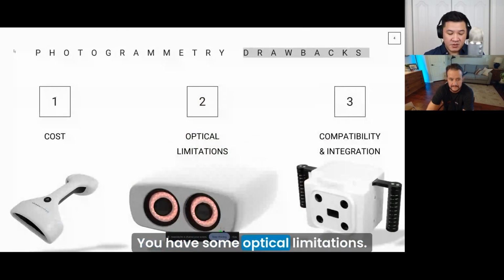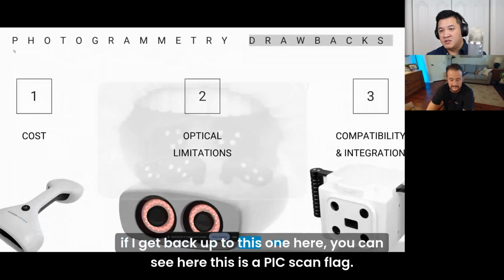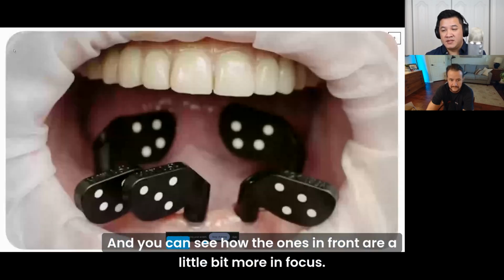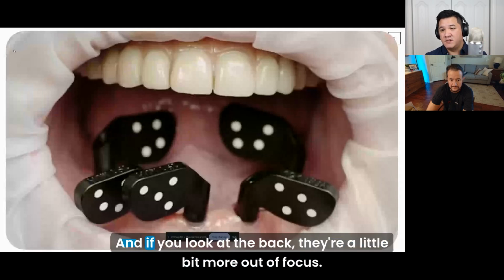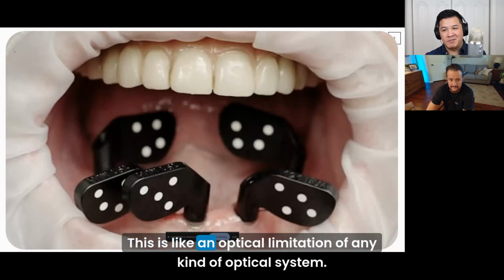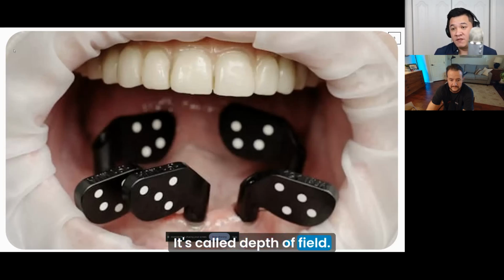You have some optical limitations. If I back up to this one here, you can see this is a PIC scan flag. The ones in front are a little more in focus, and if you look at the back, they're a little more out of focus. On a mandible all-on-4, that's not going to be a big issue. This is an optical limitation of any kind of optical system. It's called depth of field.